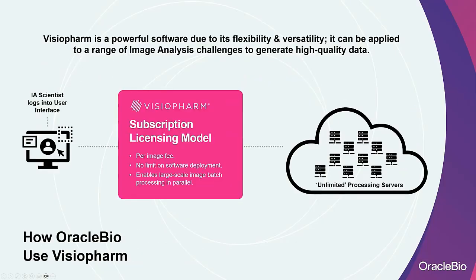We use a purpose-built AWS cloud infrastructure that allows users to spin up multiple CPUs or GPUs simultaneously. And the subscription model we have with Visiopharm allows us to maximize the productivity of our IA team to generate data quickly and efficiently. We're charged per image imported into the software, meaning in combination with our cloud computing-based deployment, we can have members of our IA team launching multiple instances of Visiopharm.